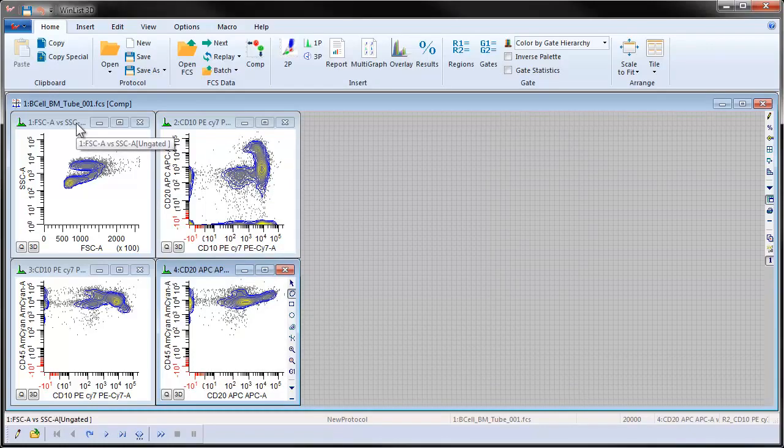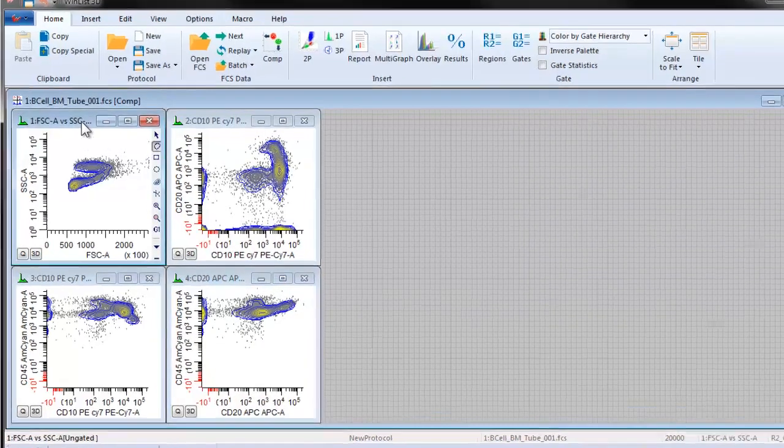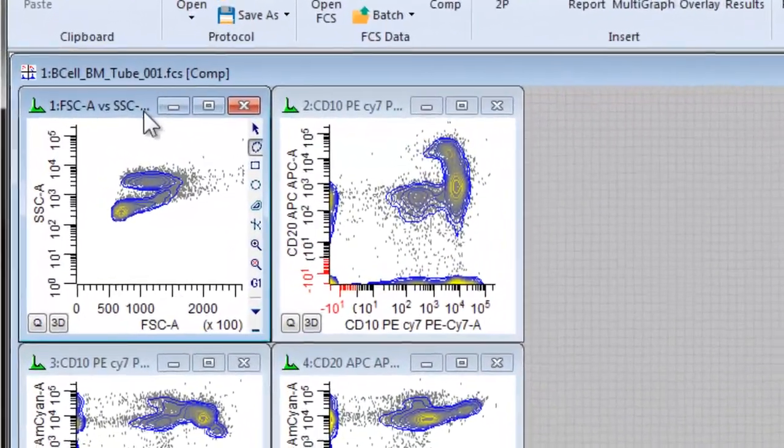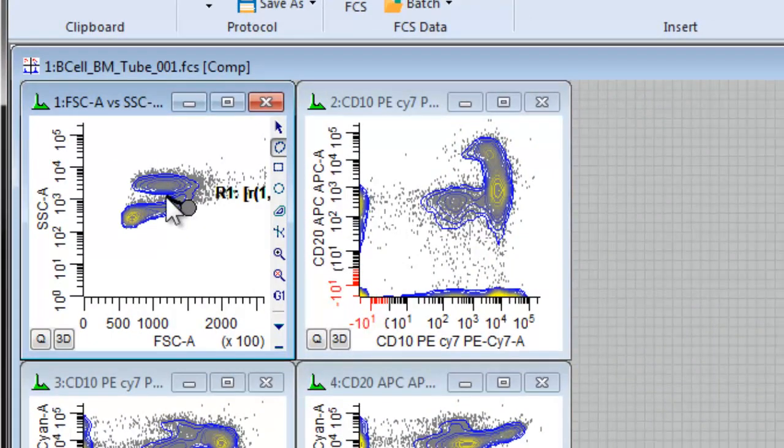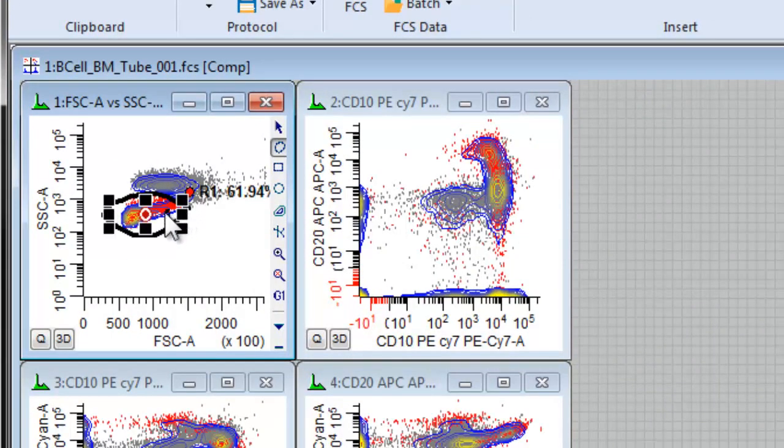We can now create regions on the histograms. In the Light Scatter histogram, let's make a freehand region R1.